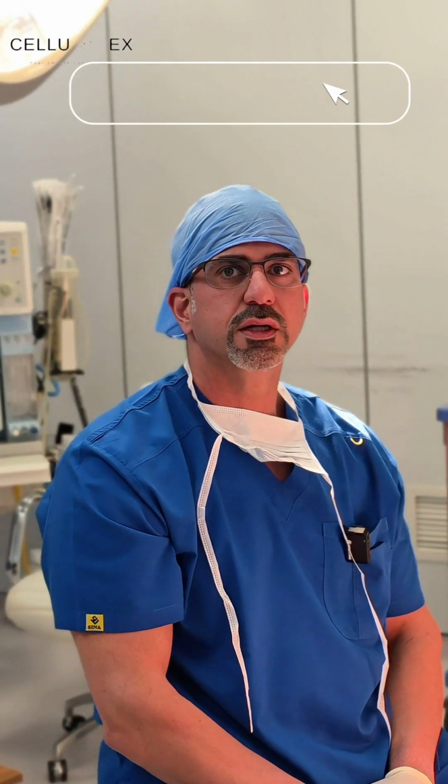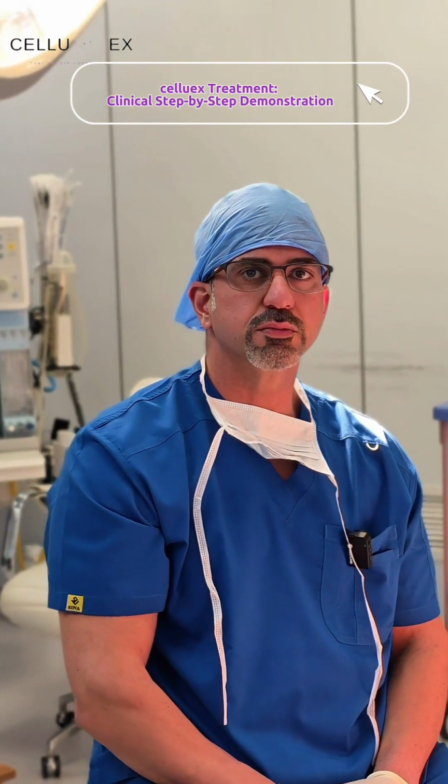Good morning, everyone. Today I'll demonstrate cellulite treatment using Celluex, which is a septal release technology. This is a live walkthrough where I'll show patient selection, marking, depth control, septal identification, release technology technique, and post-procedural care. The key concept to remember is that cellulite is a structural problem caused by fibrous septa tethering the skin, and Celluex releases target the cause itself.